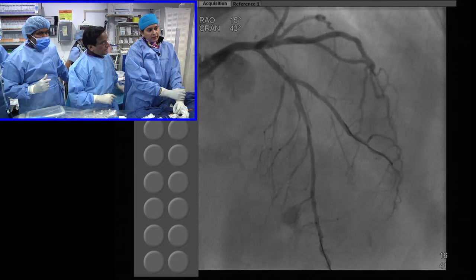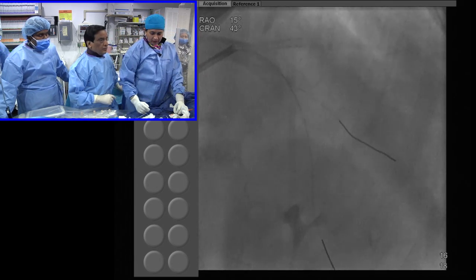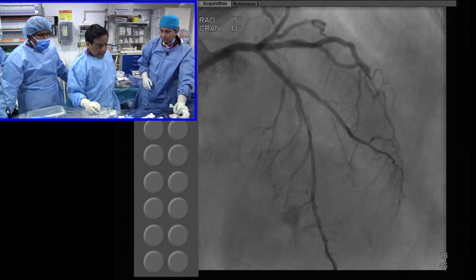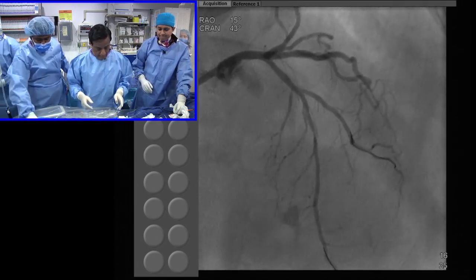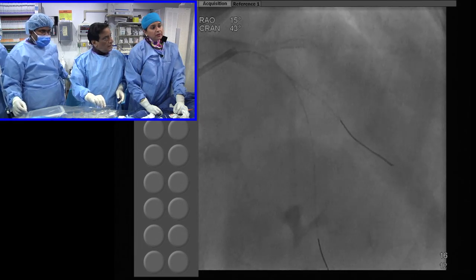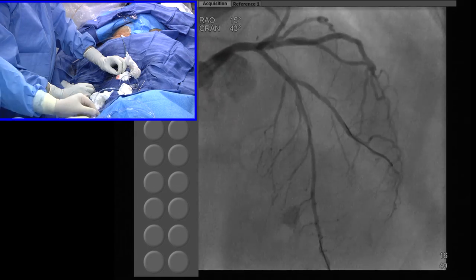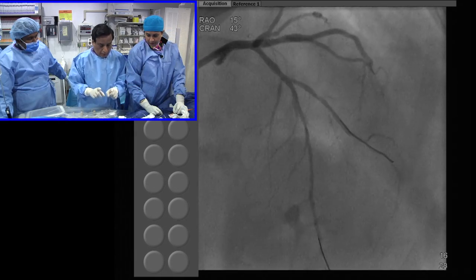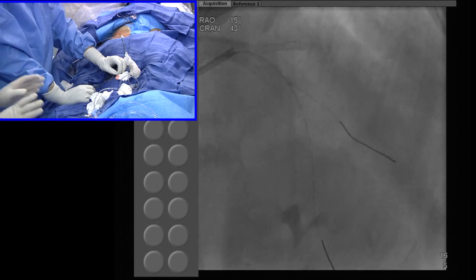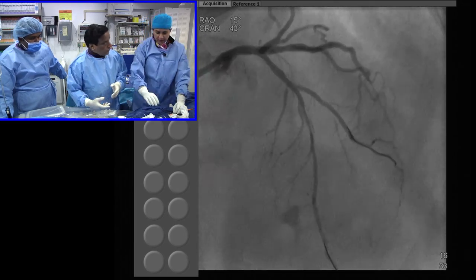So we can take 18. That's 2.5 18. Then 28 may be too much, and you may not come up to the... No, it will not be too much. Otherwise, we will have too much overlap of the BVS. Yeah, it will not be. 2.5 18. Do you want to take this one out? My thing is, let's do it. You want a 3 or 28, right? Proximally, now, makes sense. The other one we also can do: you deploy the stent, do a mini crush, open the ostium. We are not doing a simultaneous, which is okay. Too many steps with the 2 stent technique.